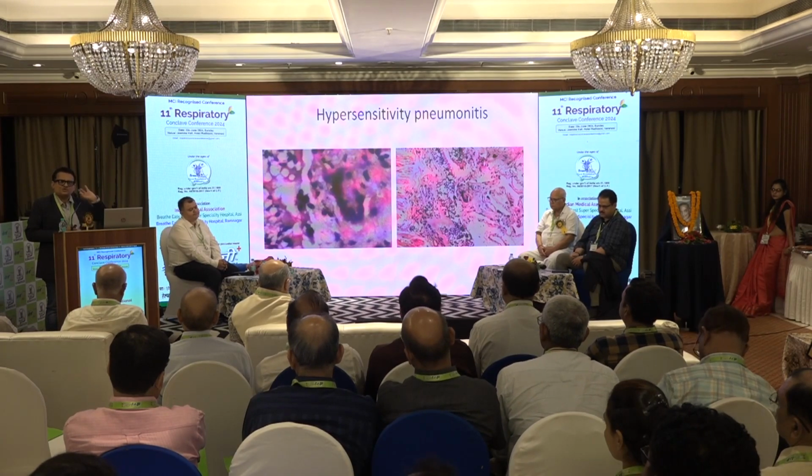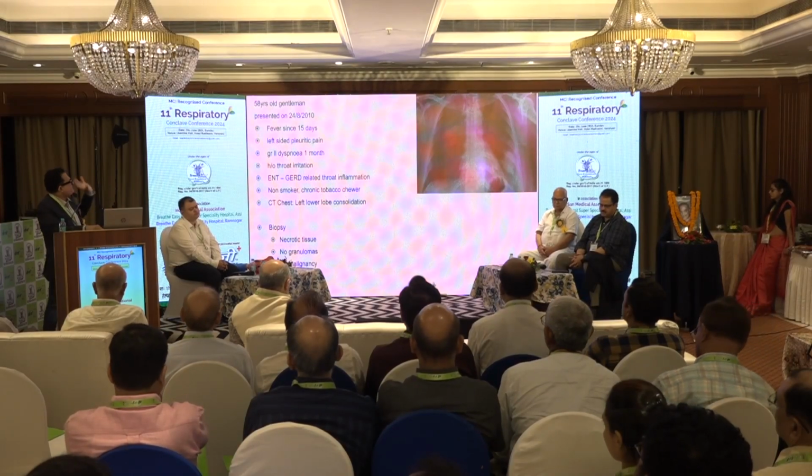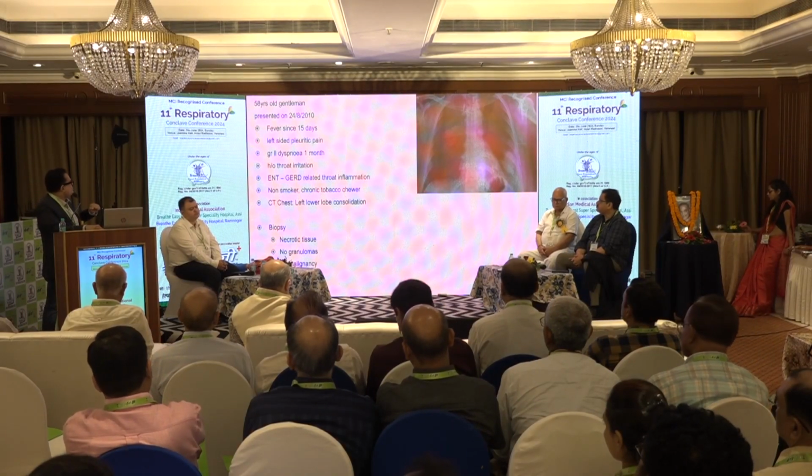So again, I've shown you transbronchial lung biopsy, and now it has matured to a cryo lung biopsy, and that has allowed us to reduce the VATS biopsies because there's more morbidity and more cost involved with VATS biopsies. We move gears now. A 58-year-old gentleman came to us. This was almost 15 years ago.